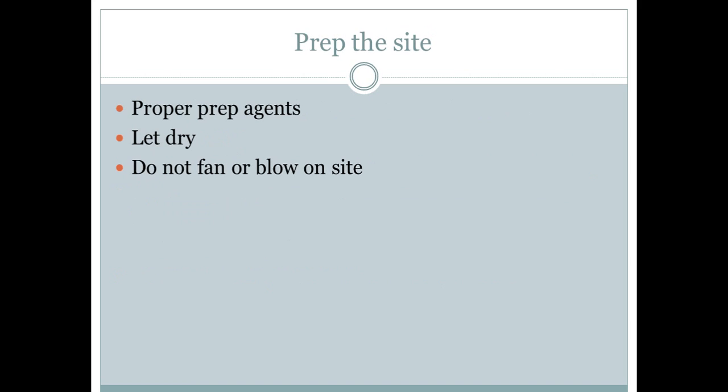You're going to prep the site. Again, according to your facility policy, you're going to use the proper agents to clean the site. Once you clean that site, let it air dry. No fanning the site, no blowing on the site.